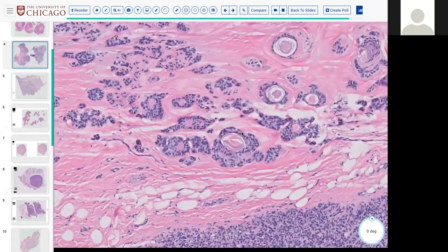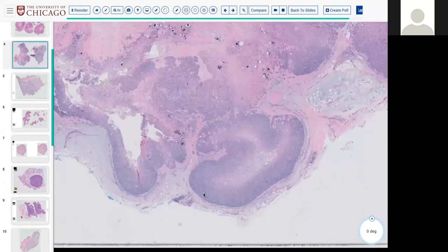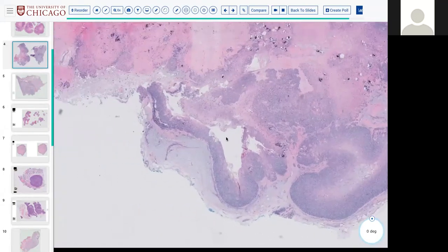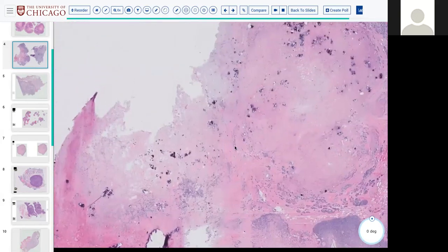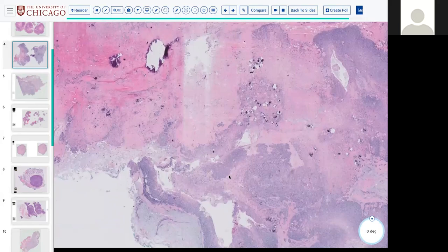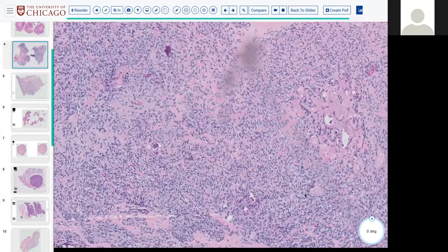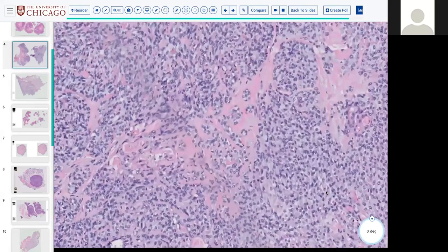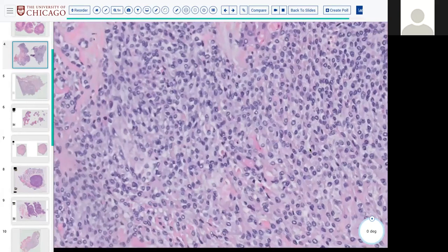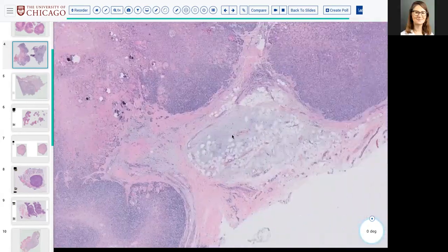So I guess I'll speak again. We have a variably cellular lesion with this hyalinized, almost infarcted-looking area that you pointed out with dystrophic calcifications. Cytomorphology, it's hard for me to do much with there, but the piece on the right-hand side is a lot more richly cellular, which I guess you want me to focus on, the more basaloid and maybe less mucinous components over here.